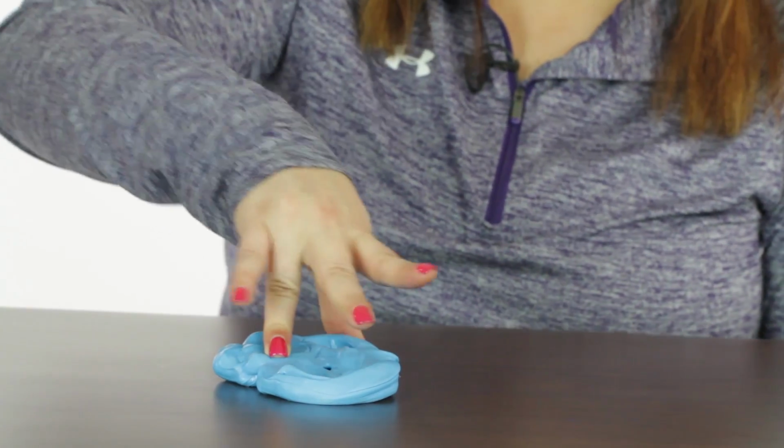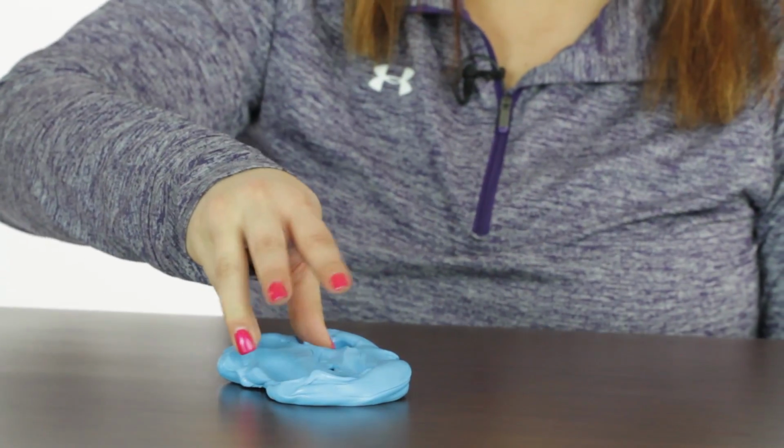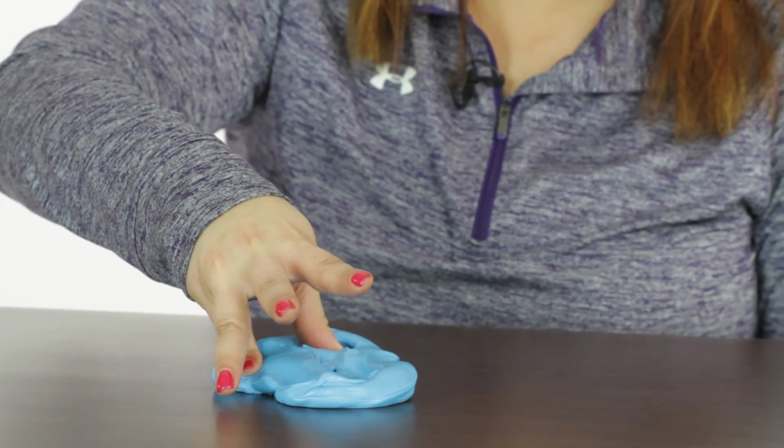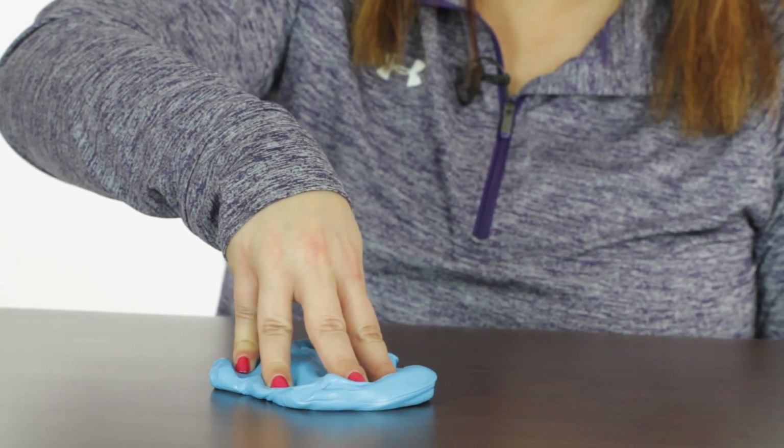And again, you can do all of these with the various strengths, just depending on what you're working on. You may be working on one finger or a whole hand. You can do a whole hand to work on spreading it out.